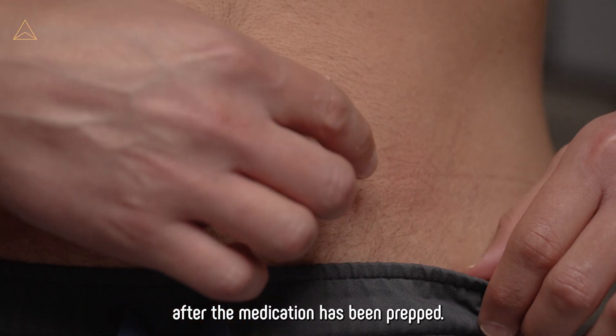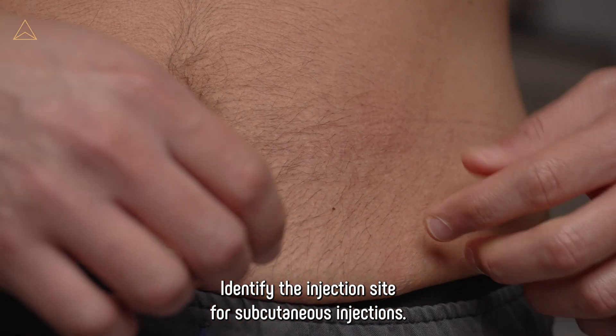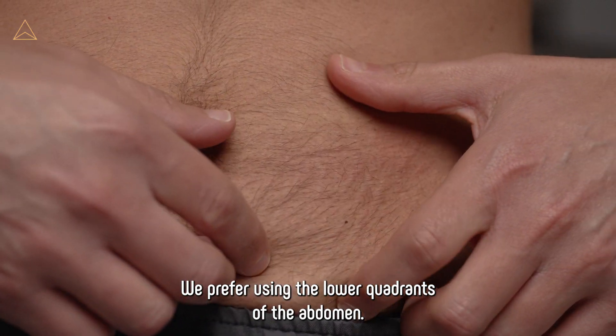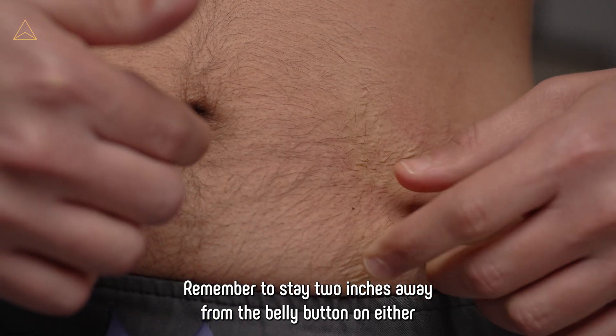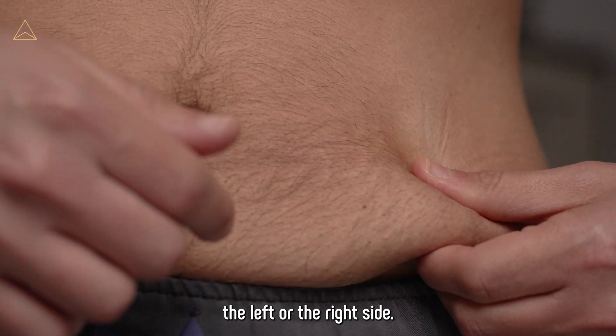After the medication has been prepped, identify the injection site. For subcutaneous injections, we prefer using the lower quadrants of the abdomen. Remember to stay 2 inches away from the belly button, on either the left or the right side.